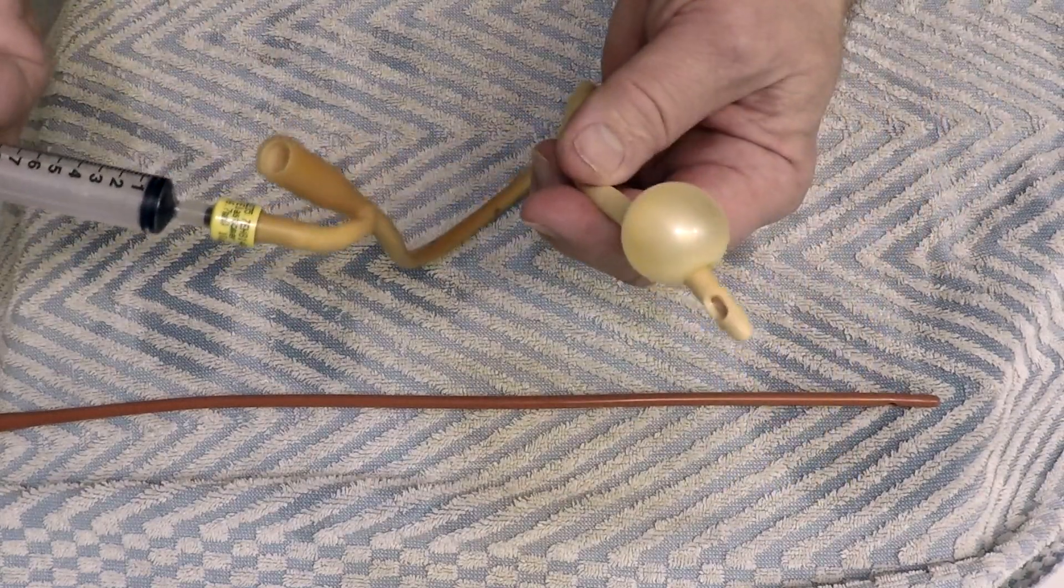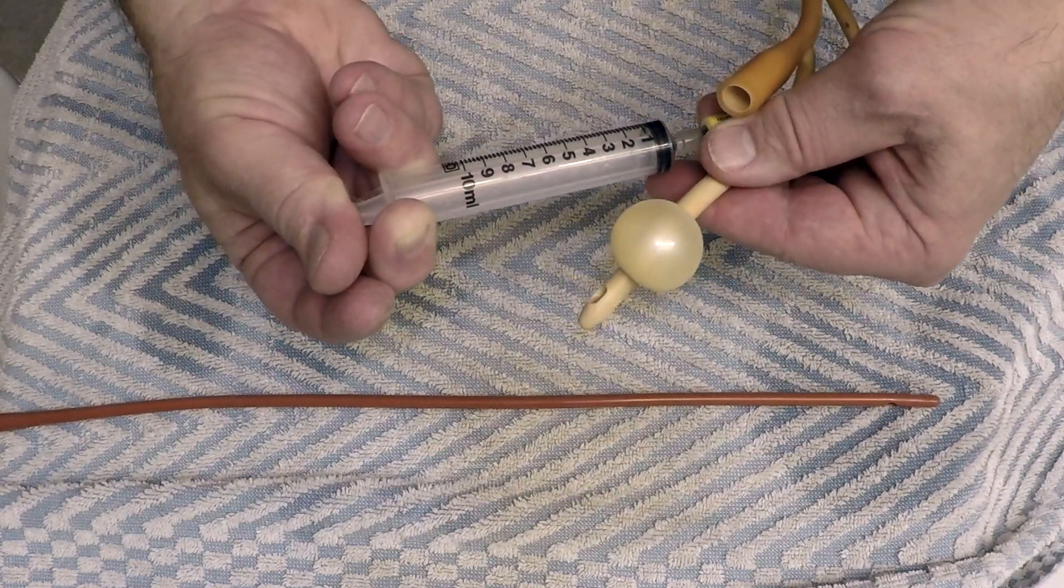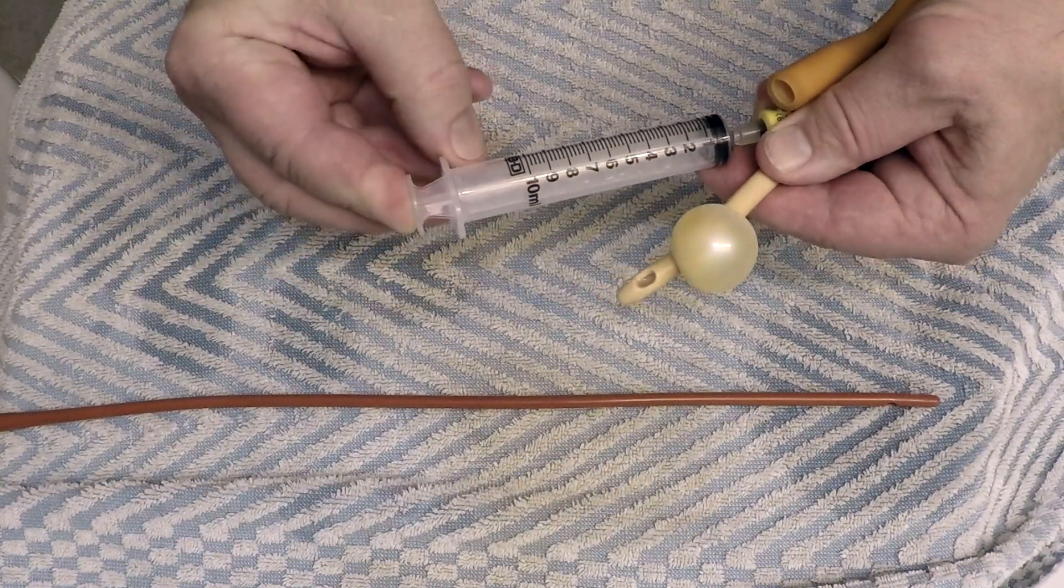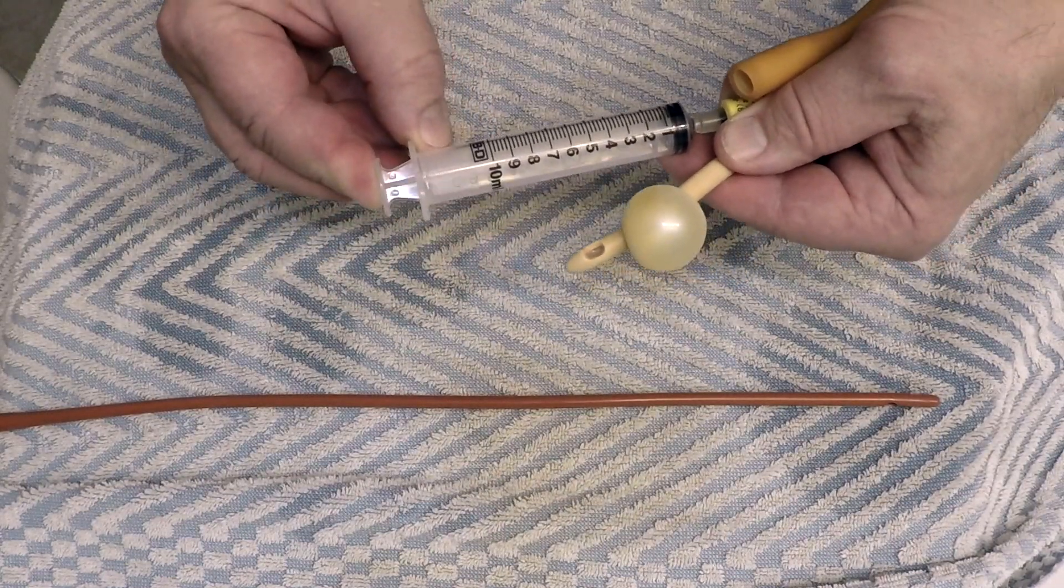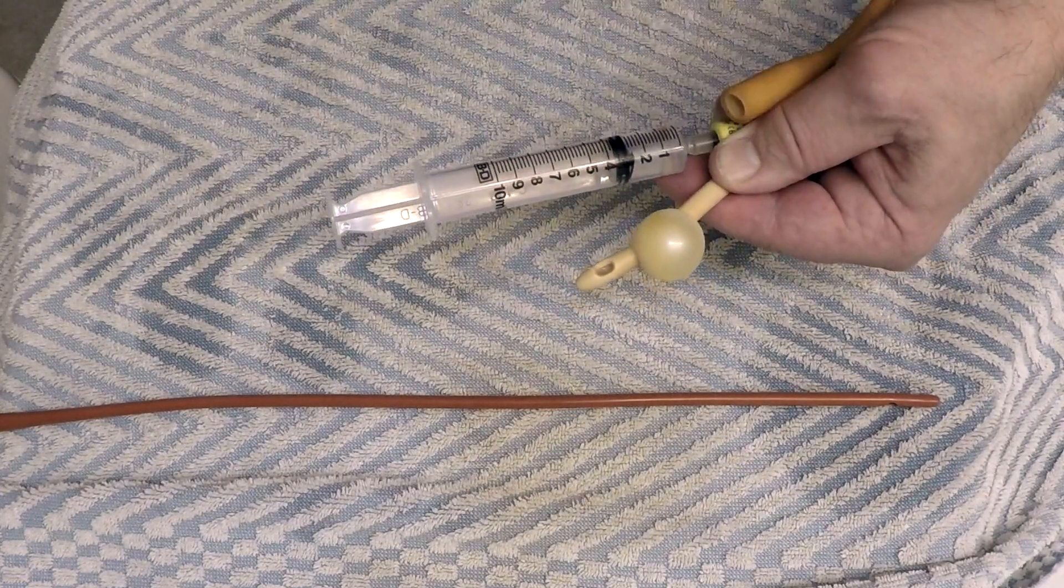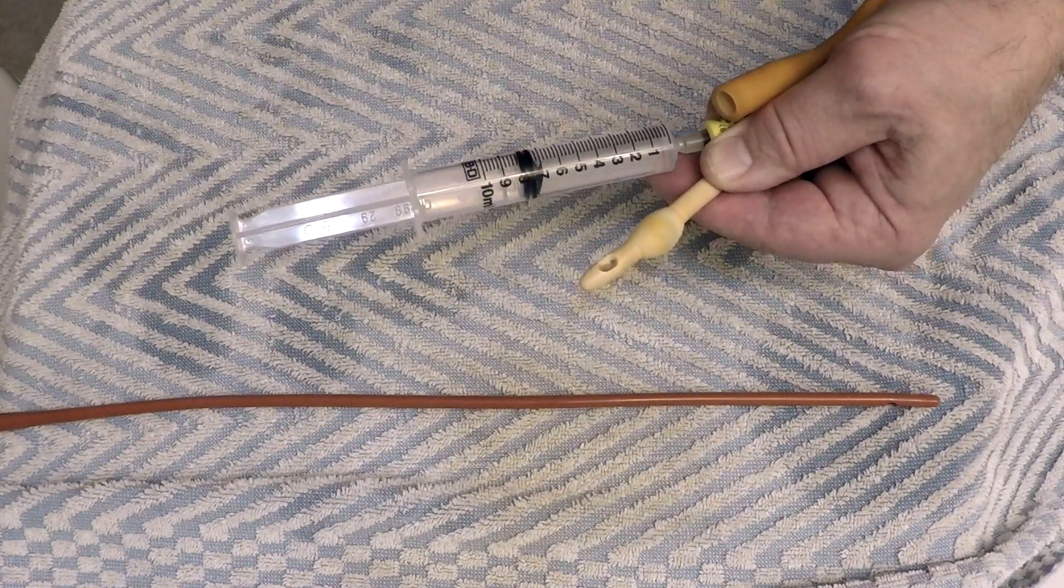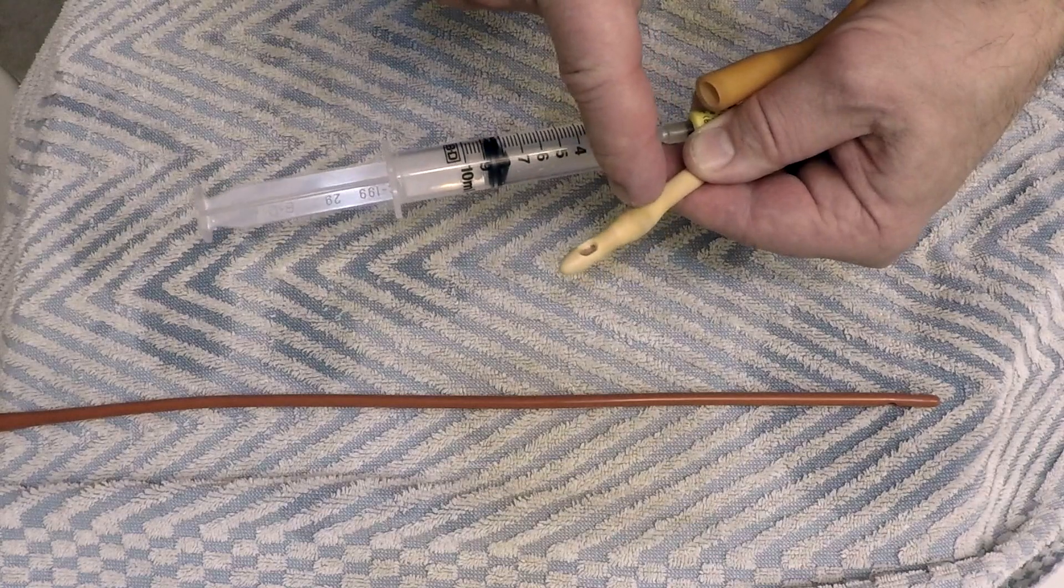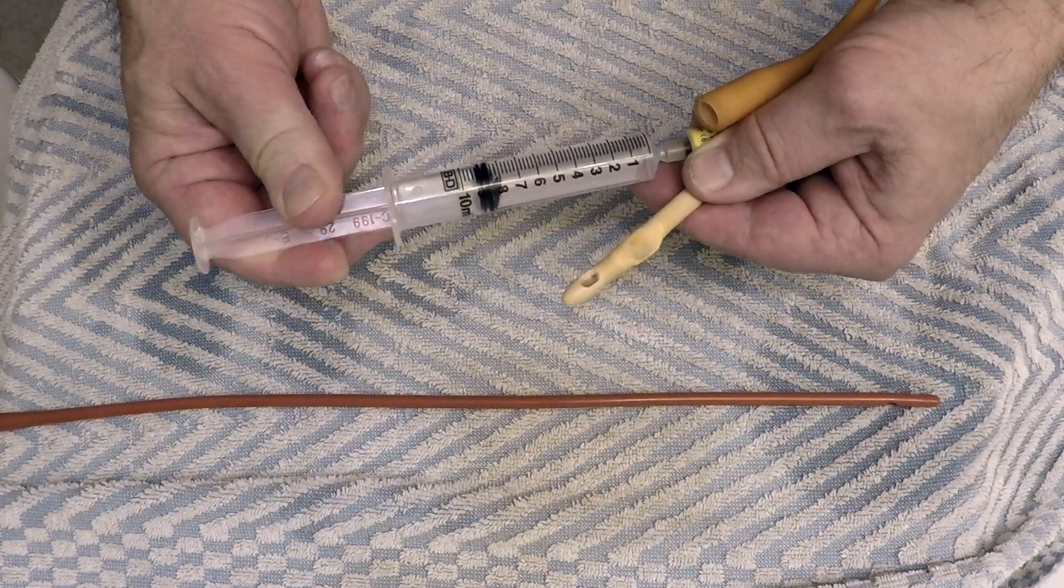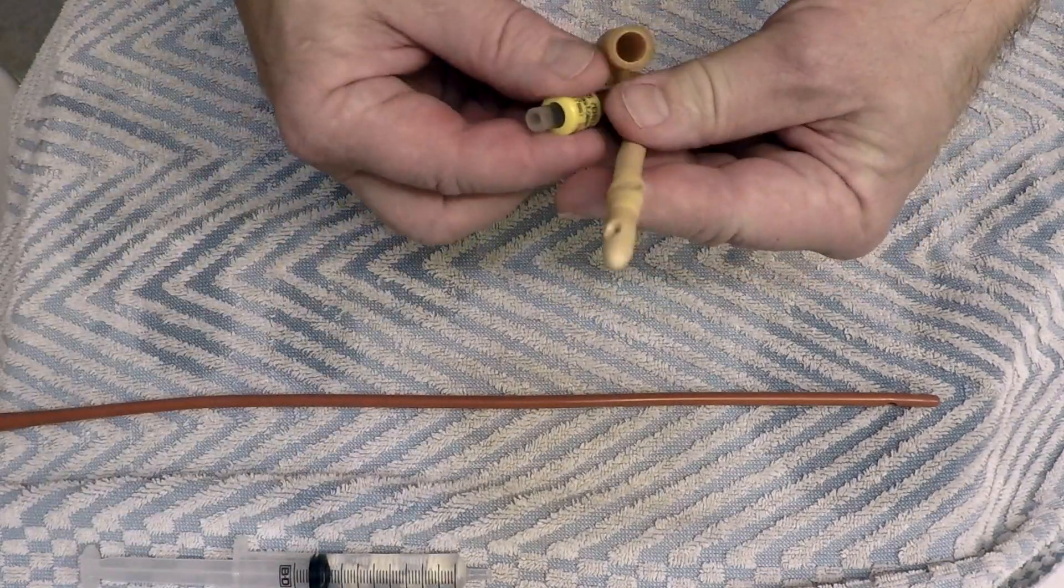Before I took it out, when I put the syringe in and was going to withdraw the liquid, I didn't even have to pull on the syringe. I'm going to let it go and you can see what happens. The pressure of the body was also on that ball, so it pushed even harder. You can see that ball has enough elasticity in it to shove the syringe right back. Now I'll just take the syringe off and there's a little check valve in there, so it won't drain anymore.